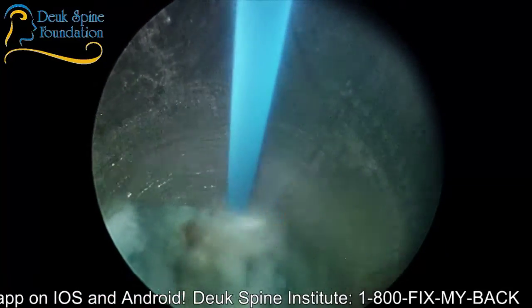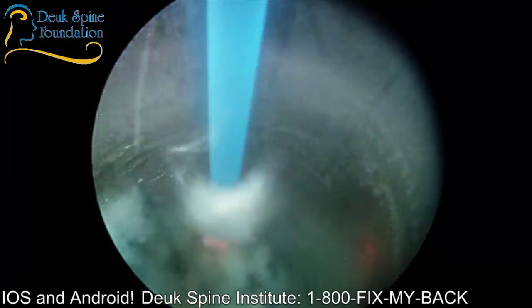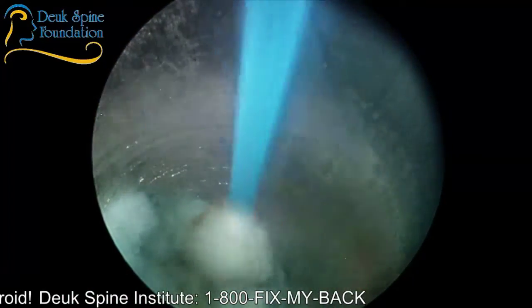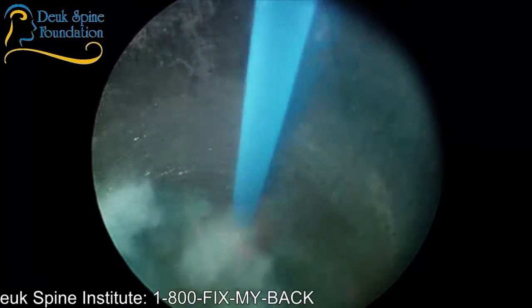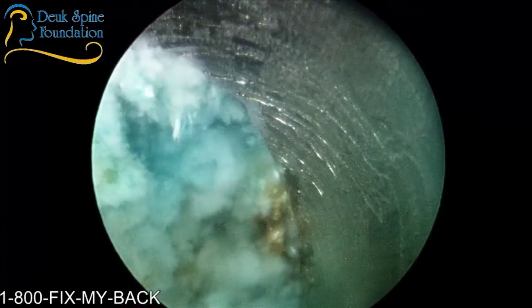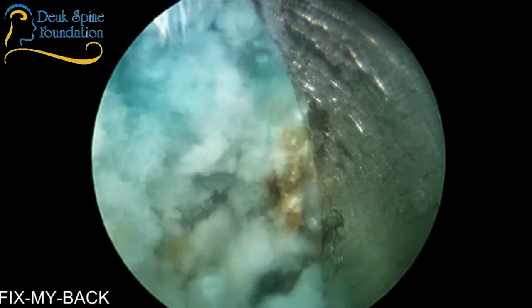I understand. That's why I'm saying keep her. I'm okay with her being lighter. She can even move around a little bit for me. It doesn't matter, as long as they're not coming off the table. And even when I was working with her earlier, she wasn't coming off. Laser standby, wipe. Back on.